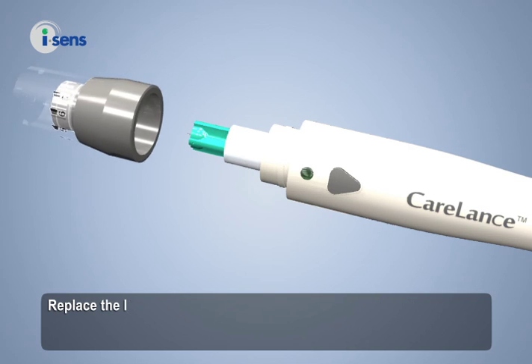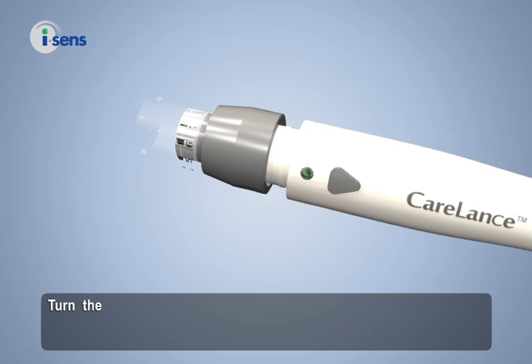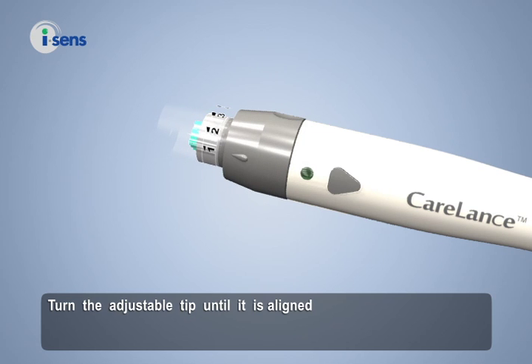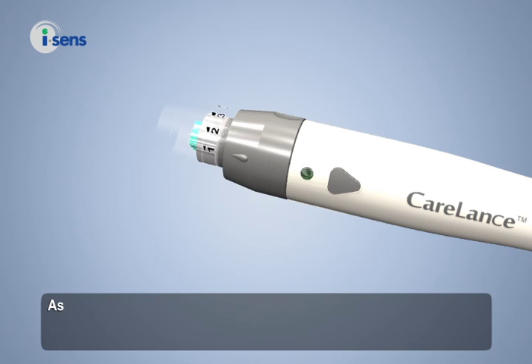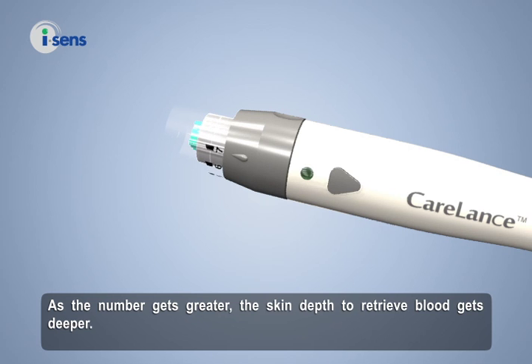Replace the lancing device tip. Turn the adjustable tip until it is aligned with the load confirmation window and release button. You can adjust the depth level of the lancing device from level 1 to level 7. As the number gets greater, the skin depth to retrieve blood gets deeper.